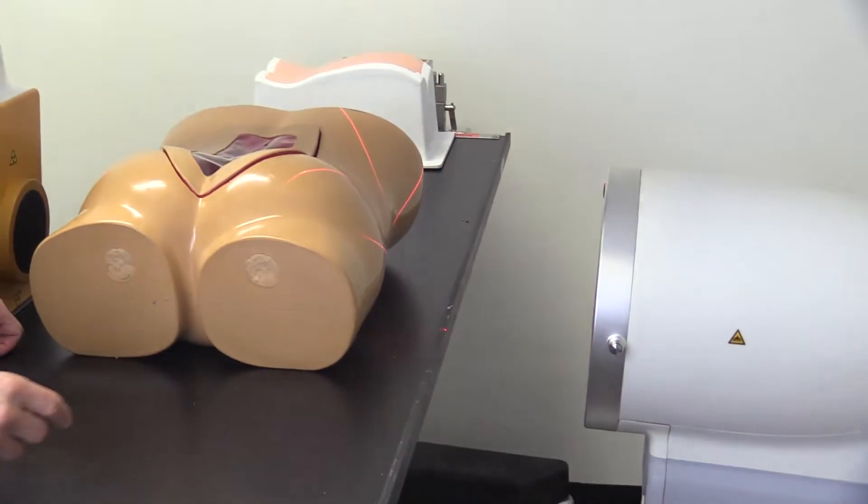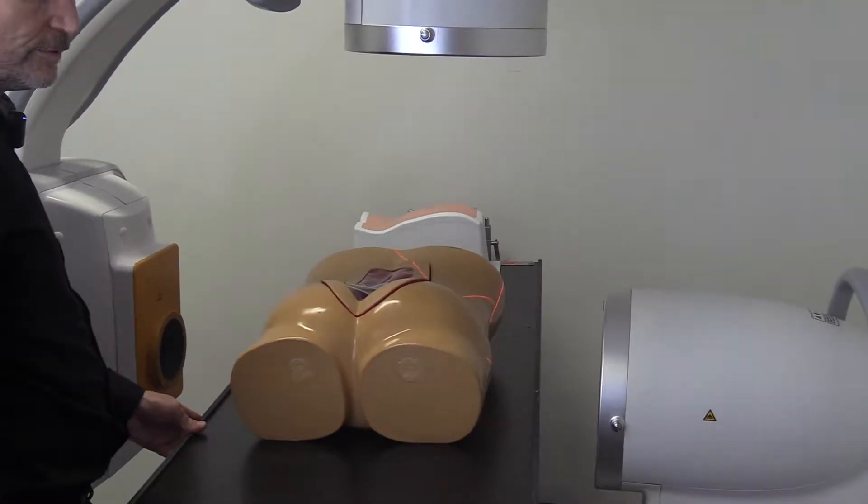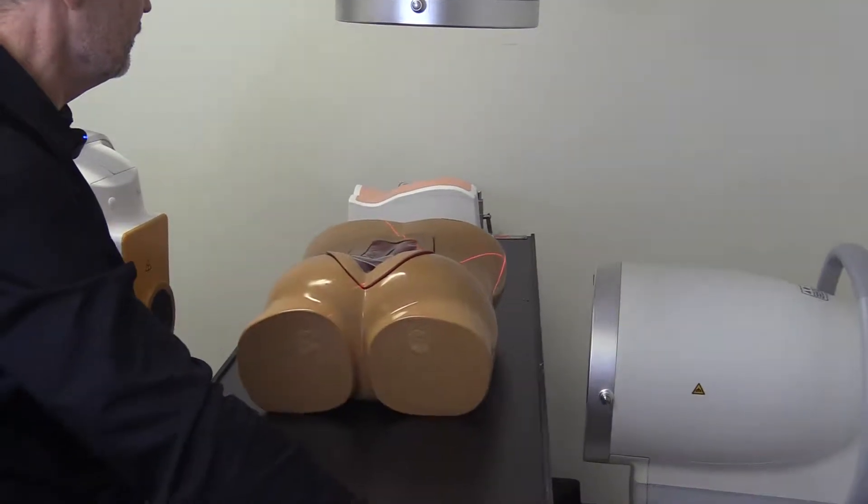Each of the image intensifiers have a button to turn on laser guides. These help get the machine in the right position quickly.